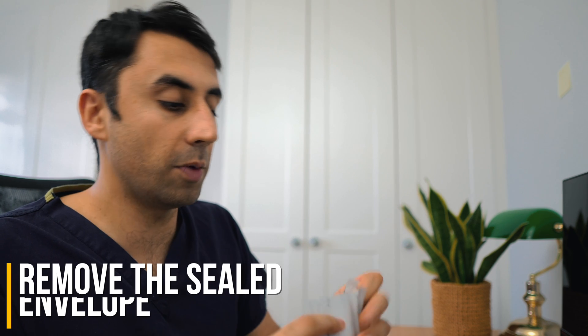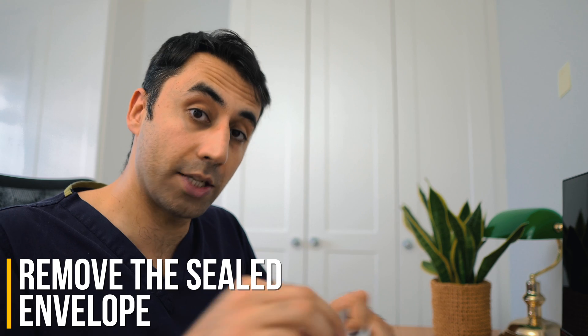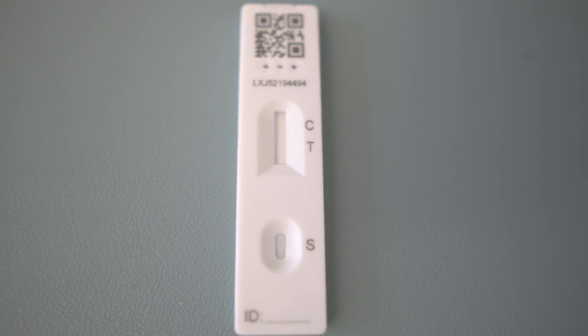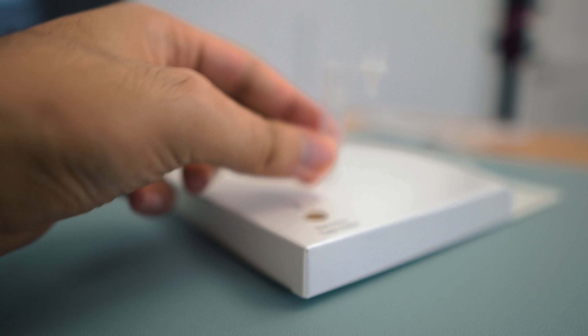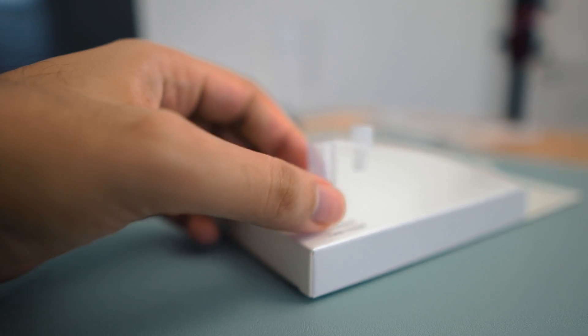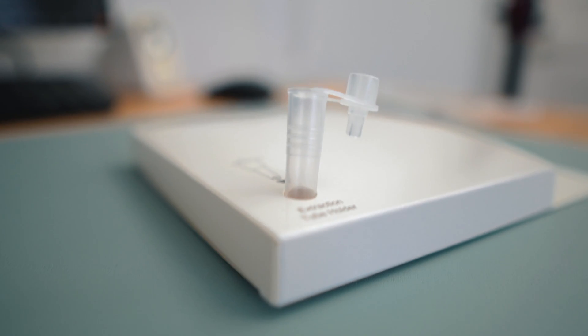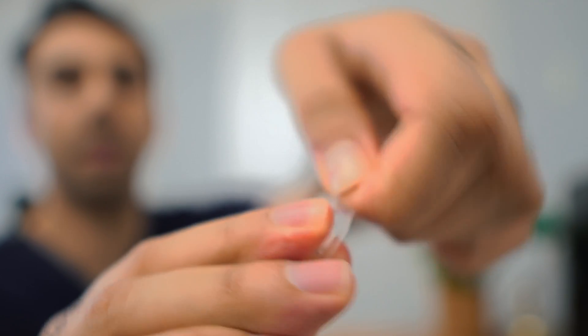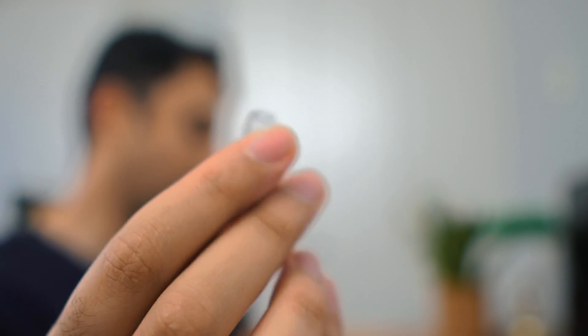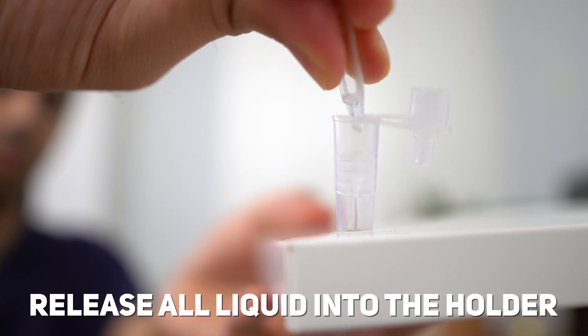Next, open the sealed envelope and take out the actual test strip, which looks like this — very similar to a pregnancy test, but it's a COVID test. Put the tube in the extraction holder; there's a little hole so it sits nice and snug. Then carefully snap open the top of the sachet, make sure you don't cut yourself, and release all the liquid into the holder.